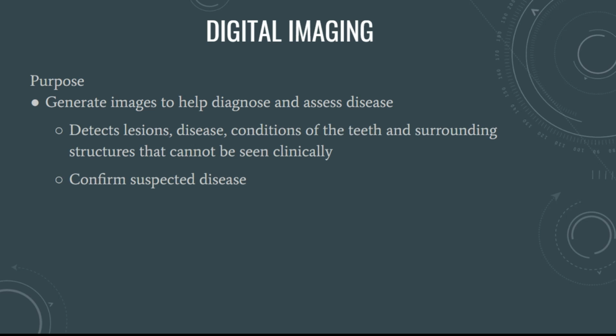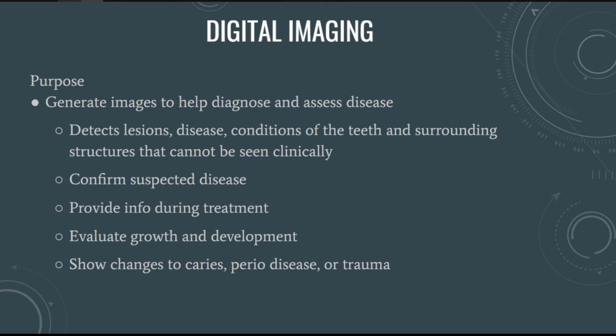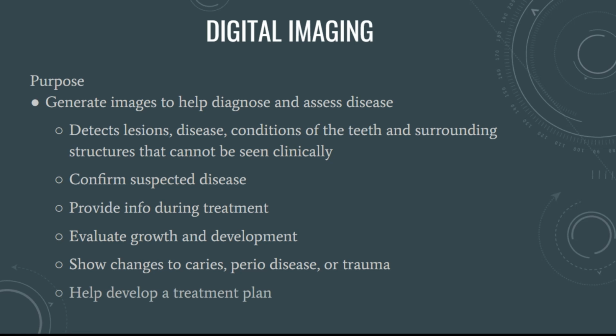It is used to confirm suspected disease, will provide info during treatment, can evaluate growth and development, and will show changes to caries, perio disease, or trauma. And it can also help to develop a treatment plan.